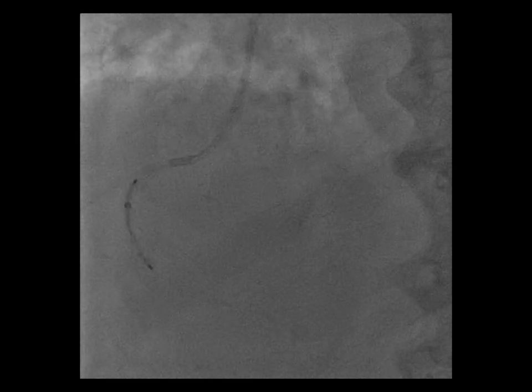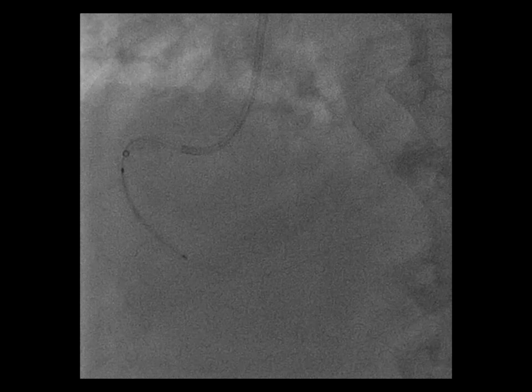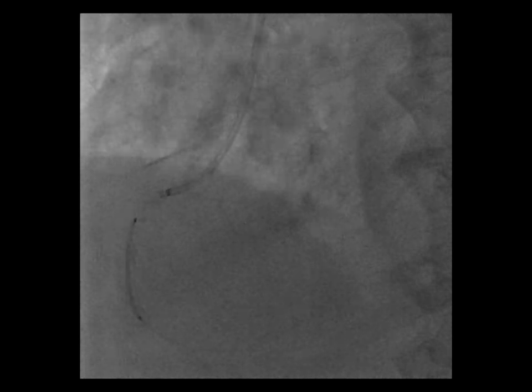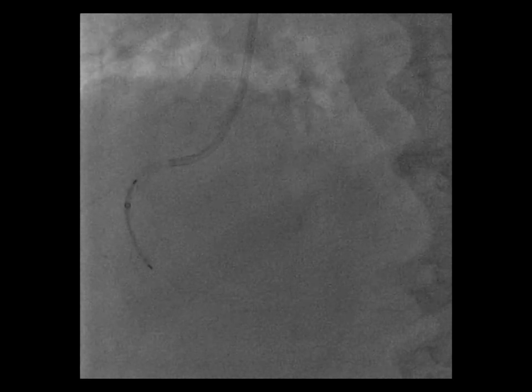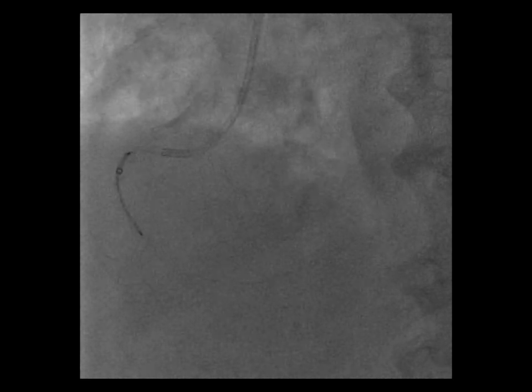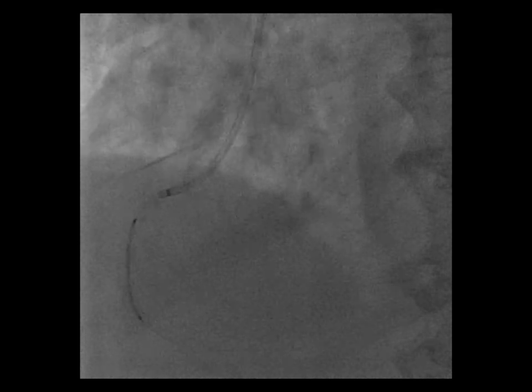Here you can see we had good guiding backup support. We could advance the guide liner over the stent that was just in the mid-RCA. Now the guide liner is in the mid-RCA, and we could advance the stent well beyond the lesion into the distal RCA.